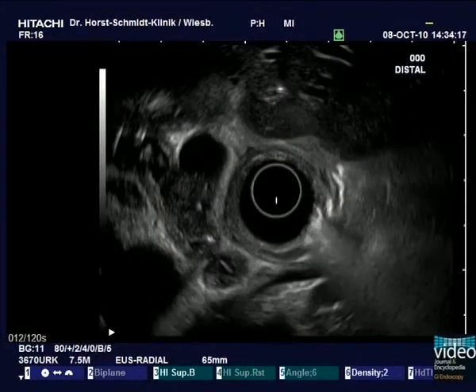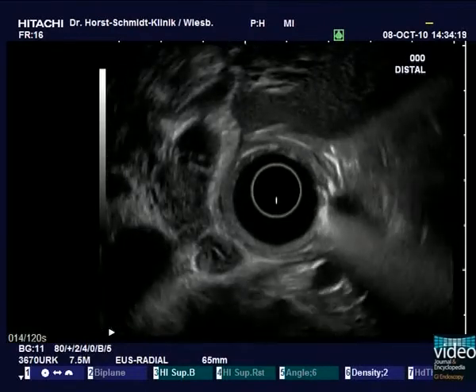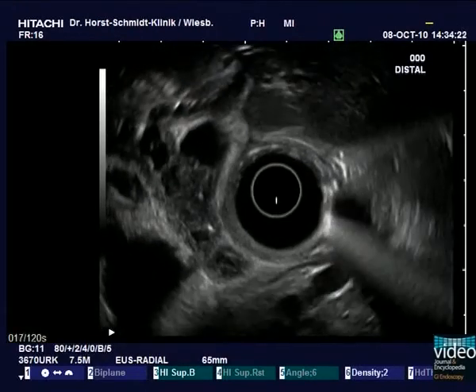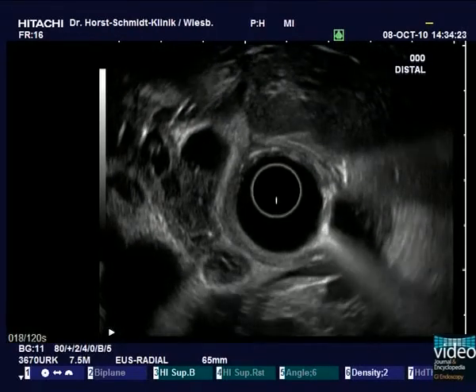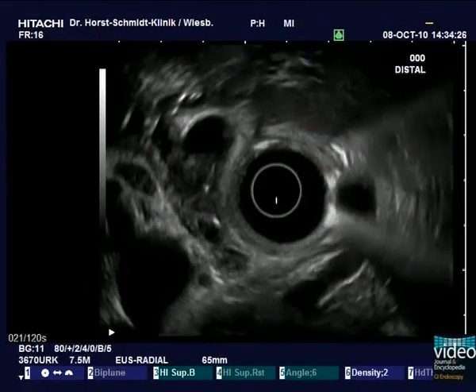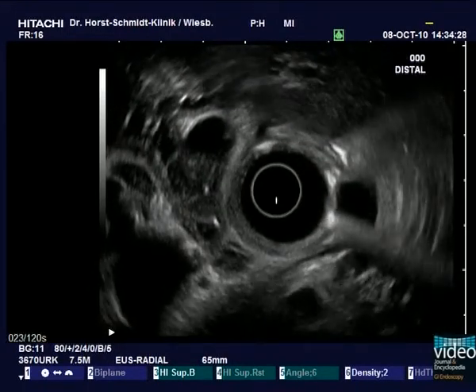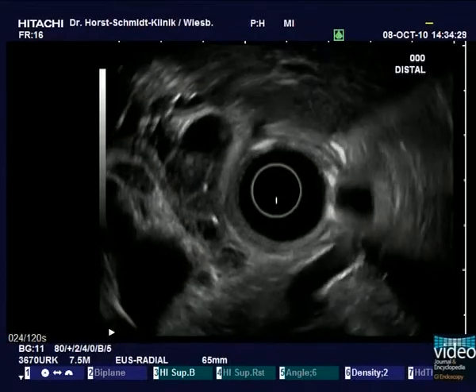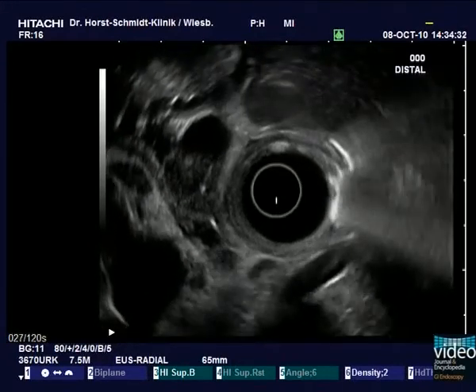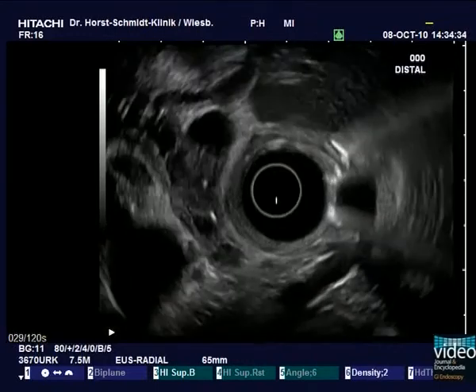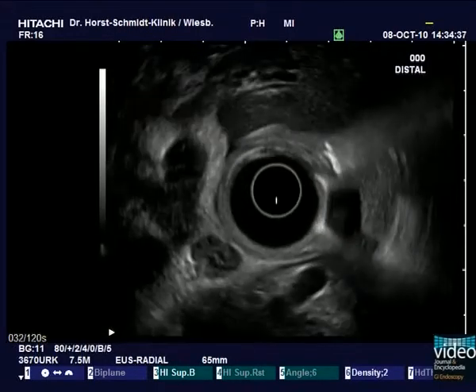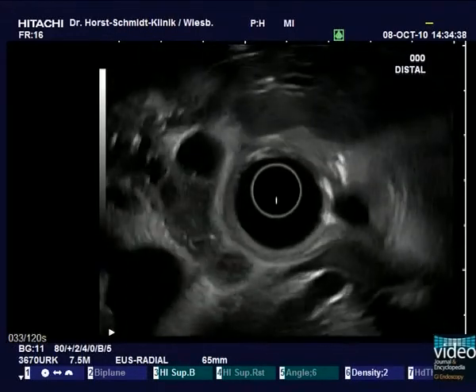In a next step, an endosonography is performed for exact staging. Positioning the transducer in the duodenal bulb offers a perfect view of the common hepatic duct, which is seen at the 3 o'clock position. Right underneath the bifurcation, the intraductal mass is clearly identified. Note the dilated right and left hepatic duct proximal to the stenosis.